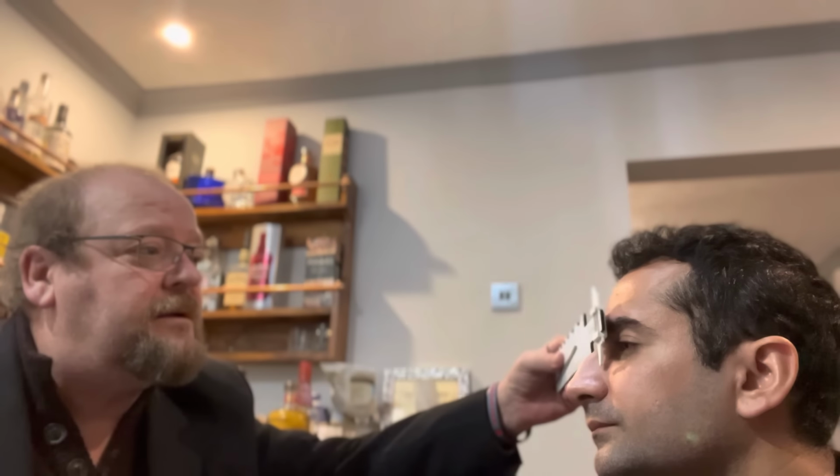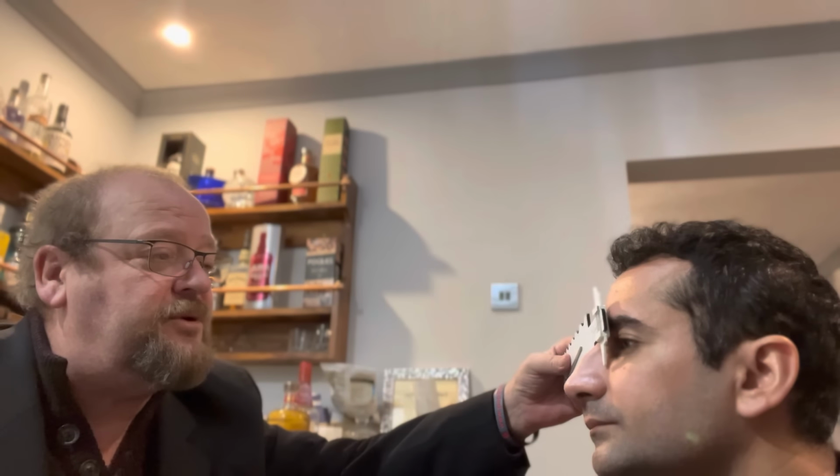The next thing I'm measuring is the DBR, which is the drop. We do 2 measurements on that. We measure at 10 and we measure at 15. When we put this on, what I'm after is 3 points of contact. We should have a point of contact right here on the top and across here.